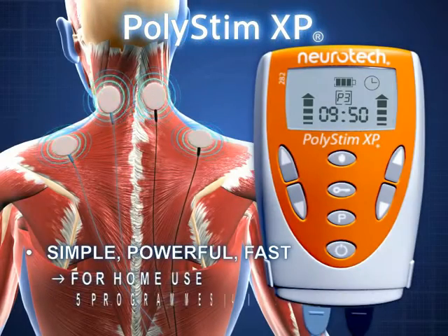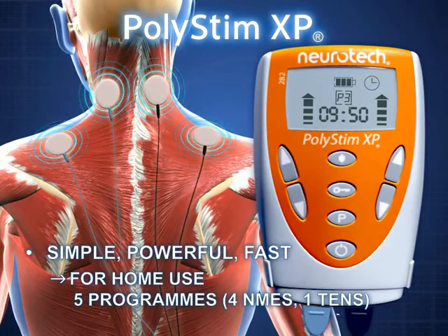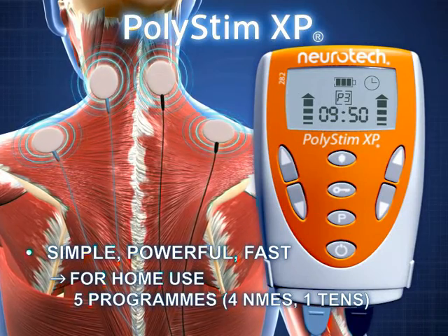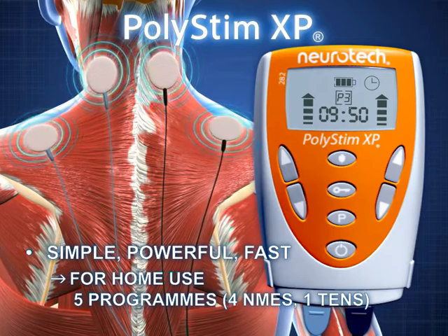The Polystim XP offers four specially tailored NMES programs for effective muscle stimulation. An additional program provides transcutaneous electrical nerve stimulation, or TENS for short, to reduce pain.